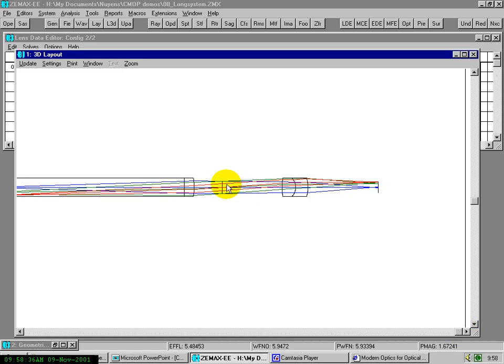And finally, we see that the aperture stop is imaged here on the exit pupil, right? Which is obvious.